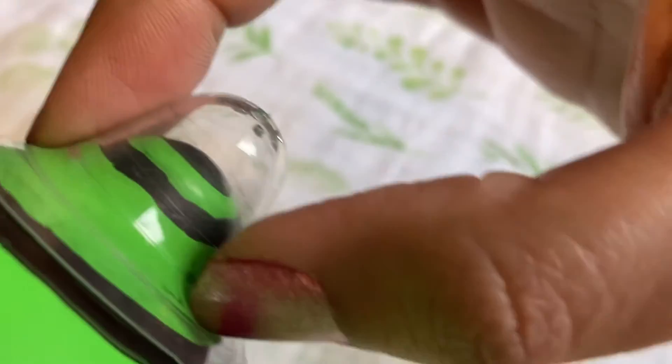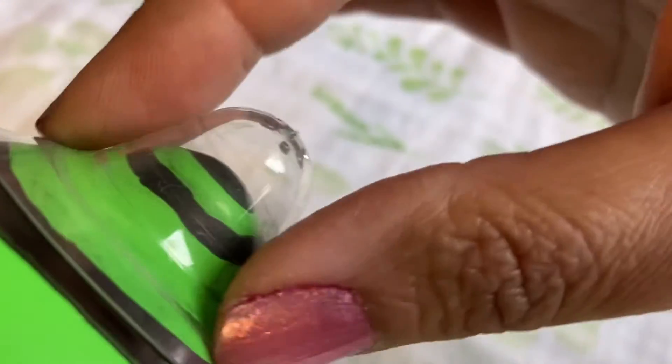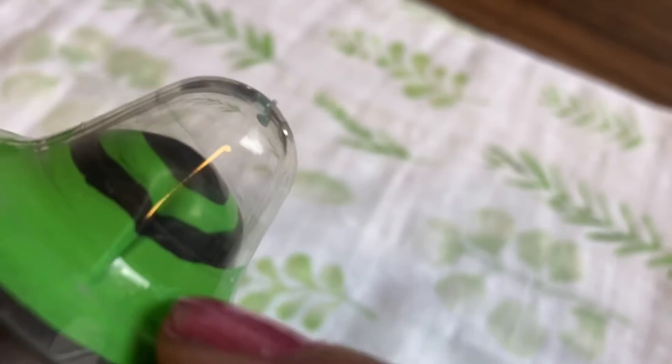Ideally, the gums will be at the very base of the nipple shield shaft so that when baby sucks, they're compressing your areola gently, not your nipple. If you have scabs or blistering at the tip of your nipple and you use a nipple shield, it can actually pull through the holes and re-injure you.